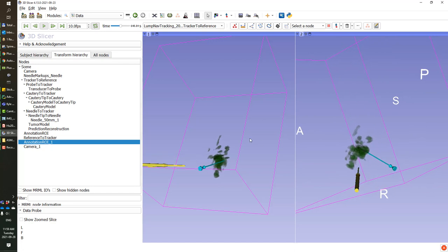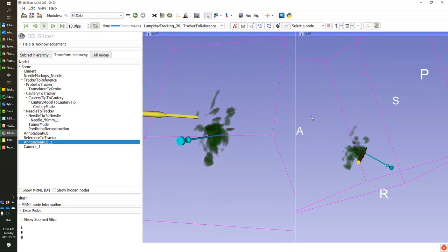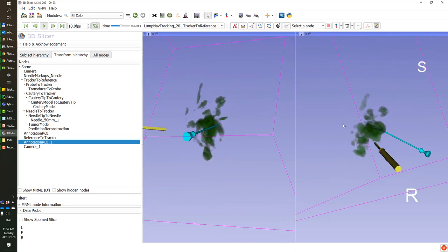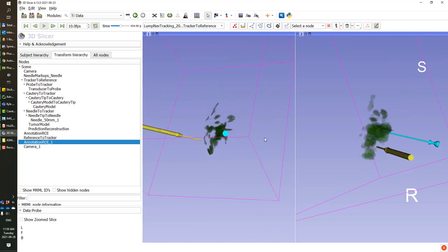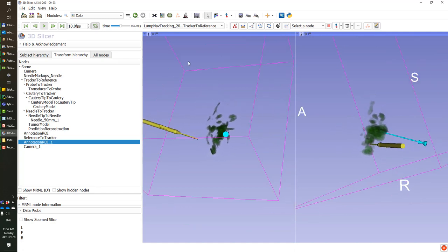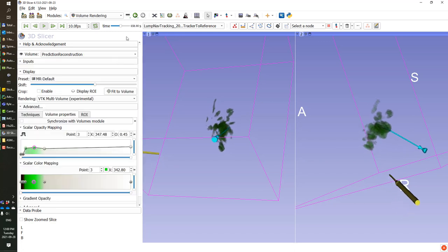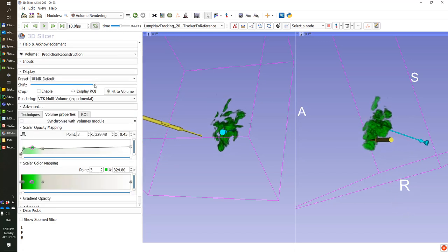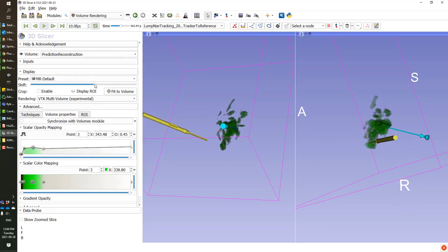Usually for surgical navigation, it's best to show at least two 3D views from slightly different perspectives, so the surgeon has a better depth perception as they are cutting around the tumor.